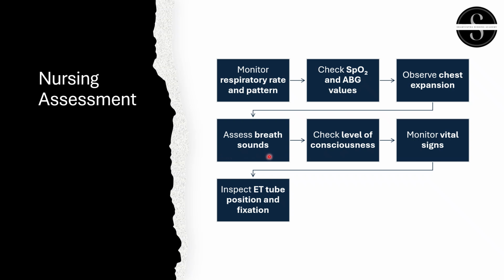Next, assess breath sound. Definitely you have to auscultate the breath sound, whether any stridor is there or any whistling sound is there. One of my internists always used to tell, the stethoscope should be at the bedside of the patient who is on mechanical ventilator, because at any time we may have to assess the breath sound. At that time you cannot go and search for the stethoscope anywhere, right? So definitely you have to assess the breath sound using auscultation methods.